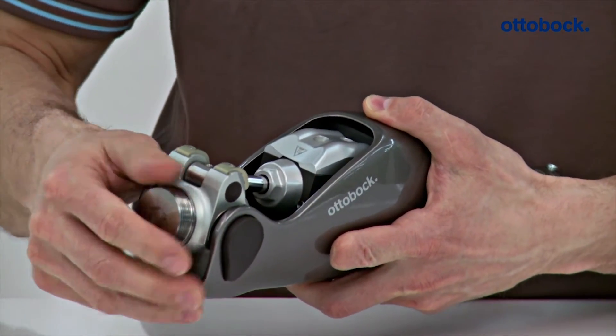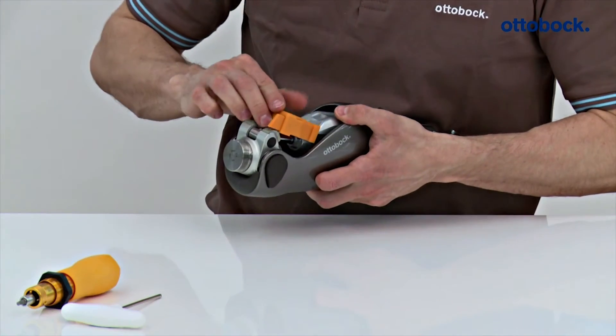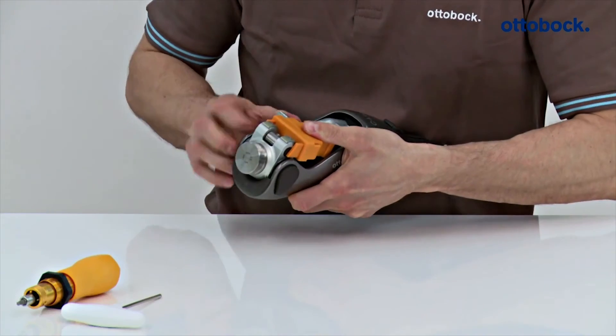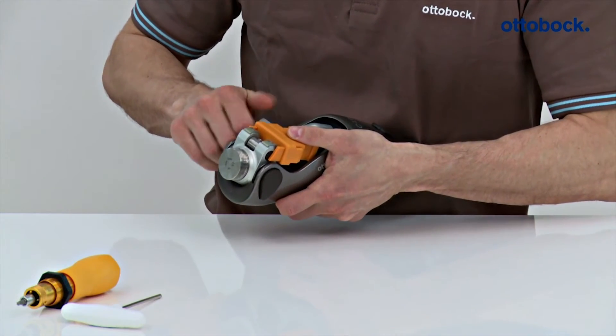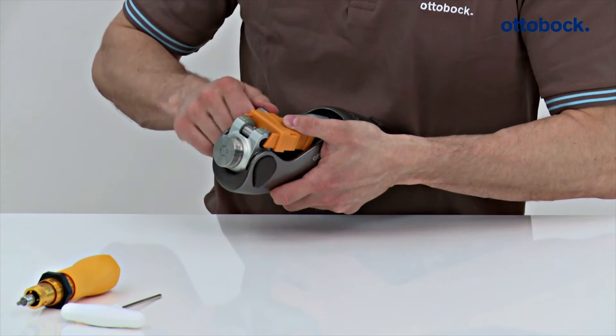Check whether both flexion stops are mounted on the knee joint. Set the knee extender onto the hydraulics housing and slide it into the stop.